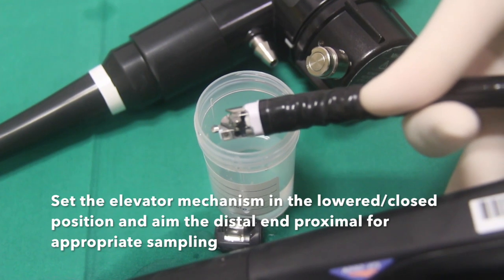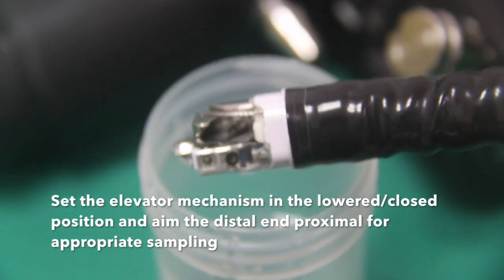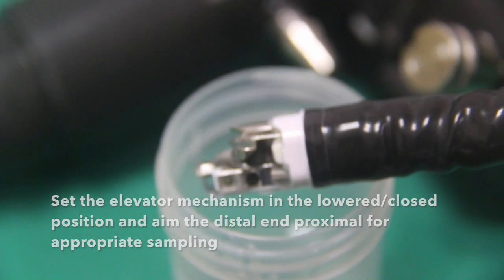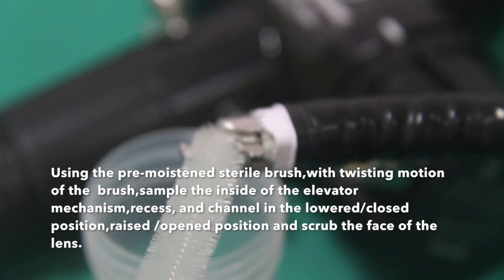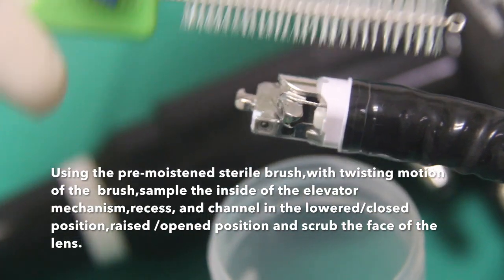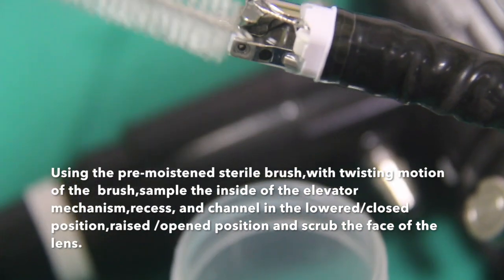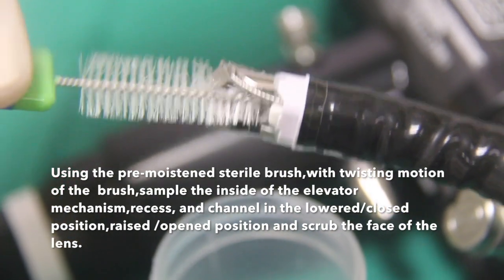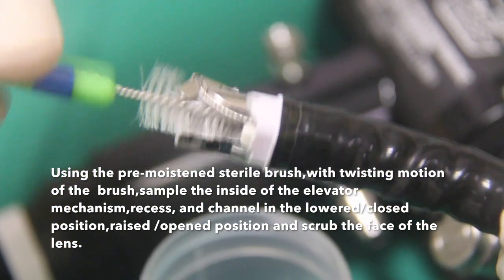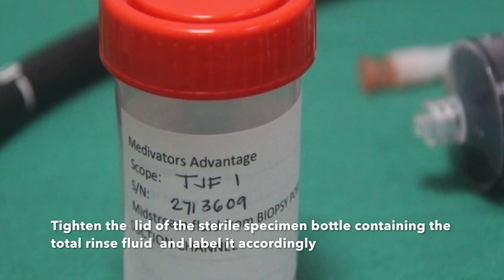Set the elevator mechanism in the lowered or closed position and aim the distal end proximally for appropriate sampling. Using a pre-moistened sterile brush with a twisting motion, sample the inside of the elevator mechanism recess and channel in the lowered closed position. Raise to the open position and scrub the face of the elevator. Tighten the lid of the sterile specimen bottle containing the total rinse fluid and label it accordingly.